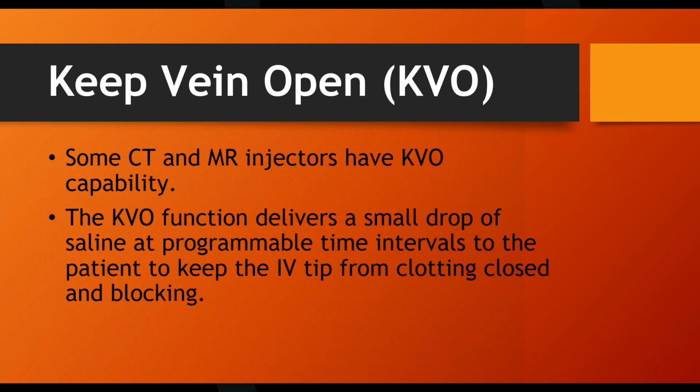KVO, if you guys are infusion pump folk, you know what KVO is, stands for keep vein open, because for CT and MRI injectors, they actually use an IV needle for the injection. If there is a long pause between fluid getting injected into the IV needle, the end of the tip of the IV needle can actually form a blood clot at the end of it. So what they do to prevent that from happening is they can turn on a KVO function.